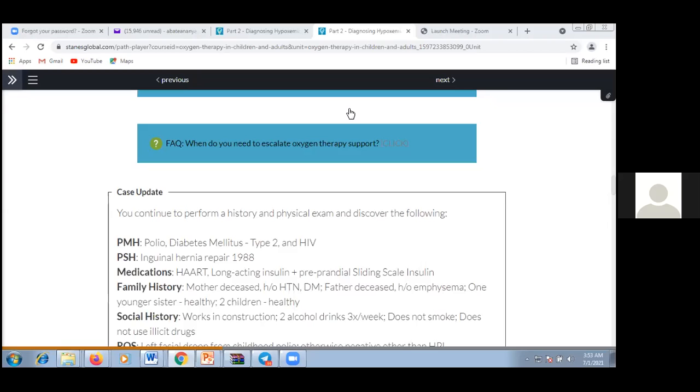And the frequency of measurement is, as you know, if there is an emergency sign, it's 2 to 5 minutes. For other follow-up is every 15 minutes, but to see if there is a need to escalate or not should not be above 2 minutes. So within 1 or 2 minutes, if the patient is not responding to our oxygen therapy, you have to escalate your oxygen, okay? And our goal is between 90 to 96%, or 92 to 96%, depending on whether the adult patient is pregnant or not.